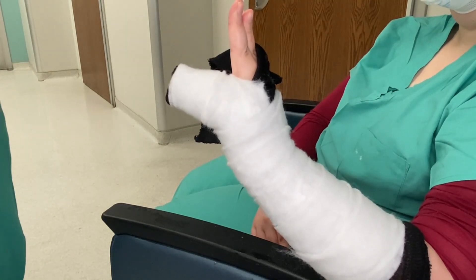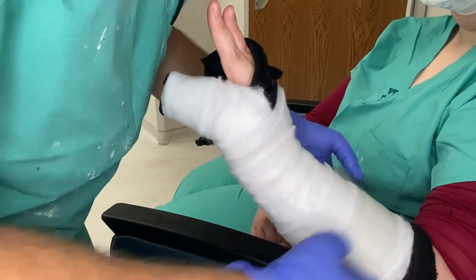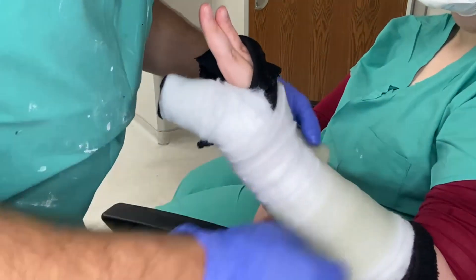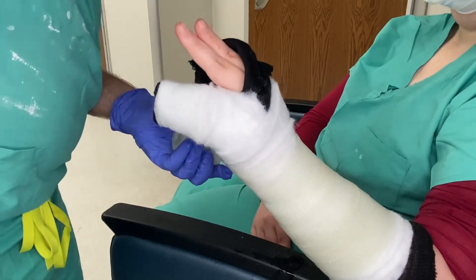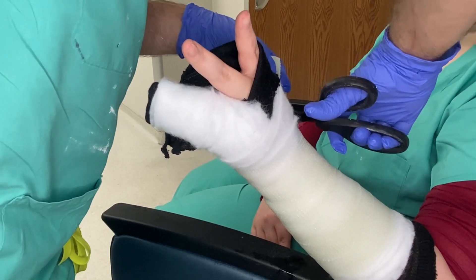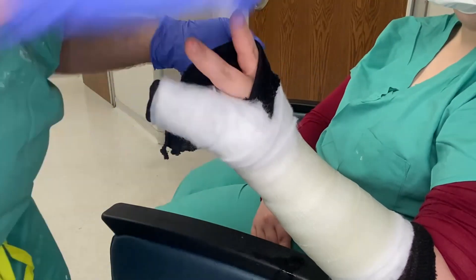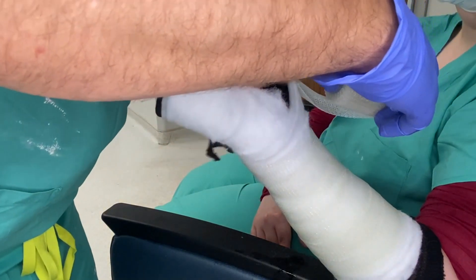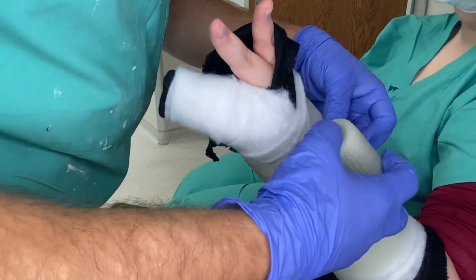Once the cotton is on, you're ready for the fiberglass. Start proximal, rolling 50-50 making sure the thumb is nice and free. Do your cuts around the thumb just like in the short arm cast — cut to where you have only a half inch showing, then do your corner fold, twist, and tuck all the little edges in. Come back and do another corner fold.